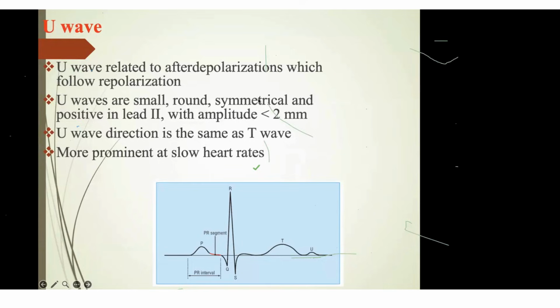The full evaluation plus interpretation is what is important in that case. It can range from a very deadly pulmonary embolism or myocarditis or acute MI to a very functional patient also. So tachycardia per se will not tell you anything, or it can be sinus nodal reentrant tachycardia also. In that case, the sleeping heart rate also will be very high. If the patient's sleeping heart rate is also more than 120 or 140, you have to further work up that patient. You will have some problem.